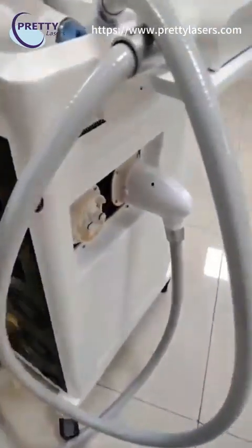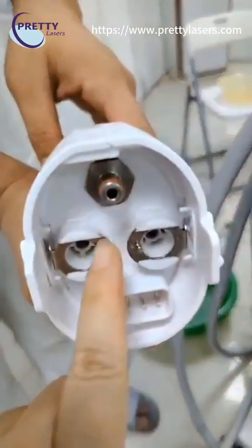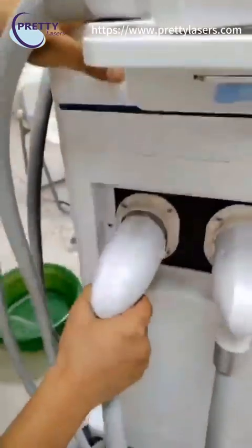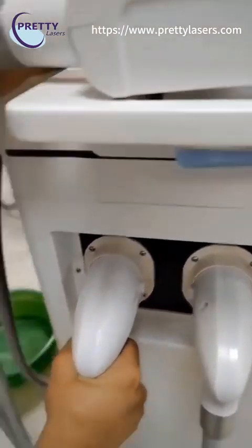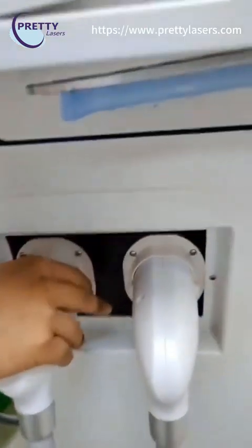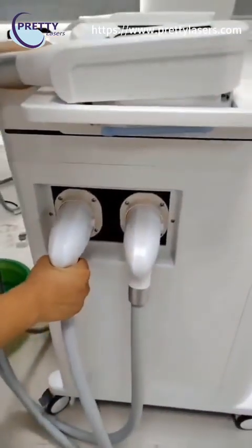Now we show how to insert the handle. Before inserting the handle, these two pins must be up, then you can insert it directly — you will hear a sound. When you want to release and take out the handle, you need to press both buttons and take it out directly. The rest are done the same way.